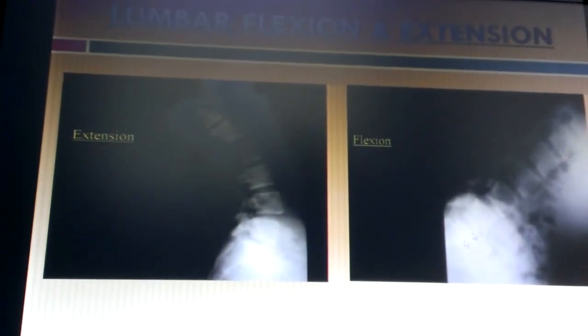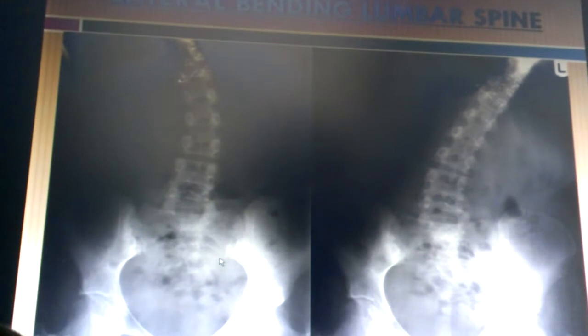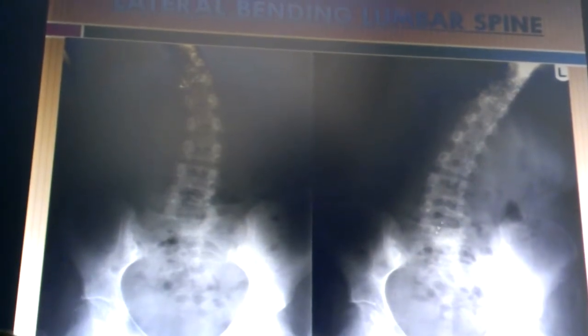Okay, we didn't talk about this much, flexion and extension. There's no justification if you think that L5 is the only vertebra with a pars defect, or if you suspect the possibility of hypermobility, which could result in instability, you might want to just do a lumbosacral spot, right? Make sure though that if it's like L3, that you're including either the 12th thoracic or the sacrum. So you can have a reference, make sure that it's L3.